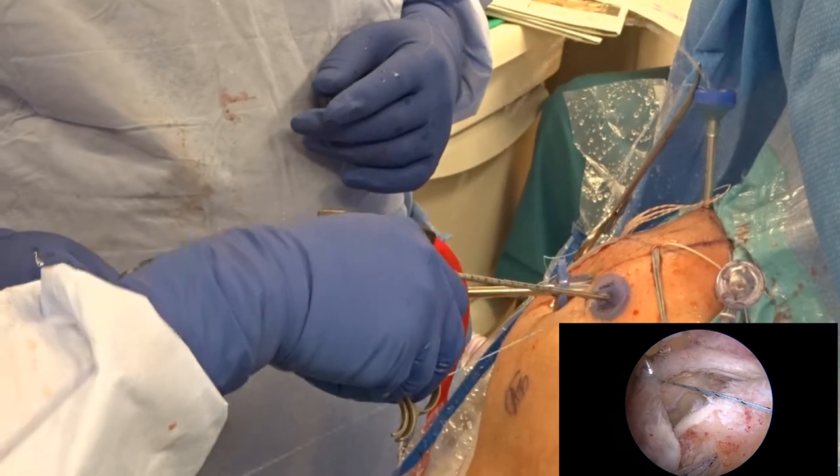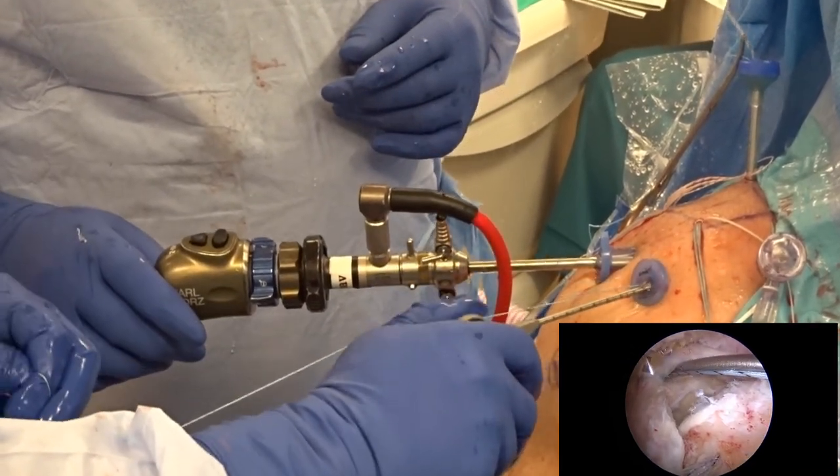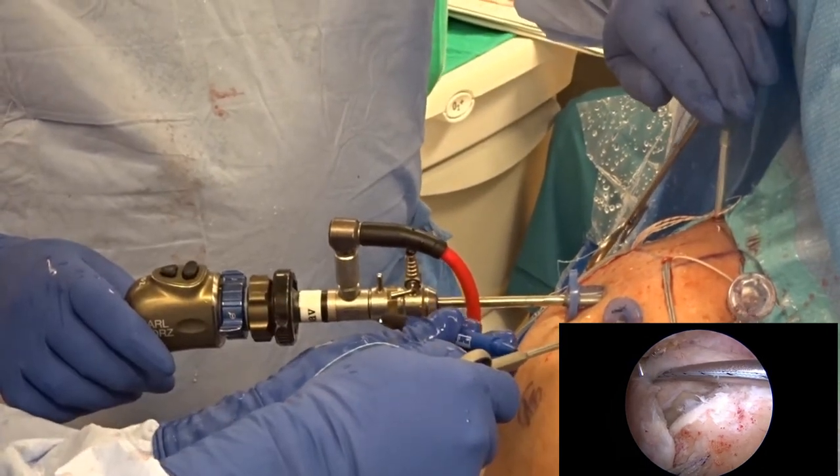Using the attached number two fiber wire to each anchor, an intra-articular measurement device is used to measure the distance between each of the anchors — medial, lateral, anterior, and posterior.